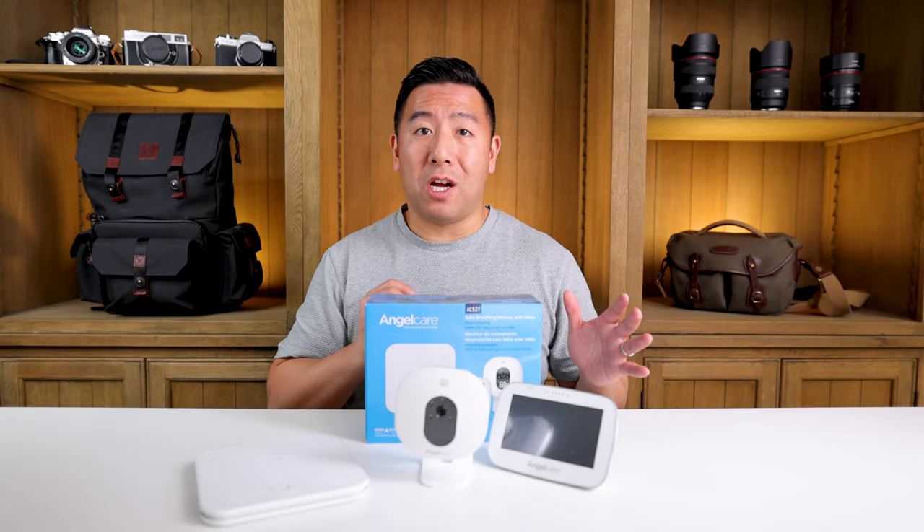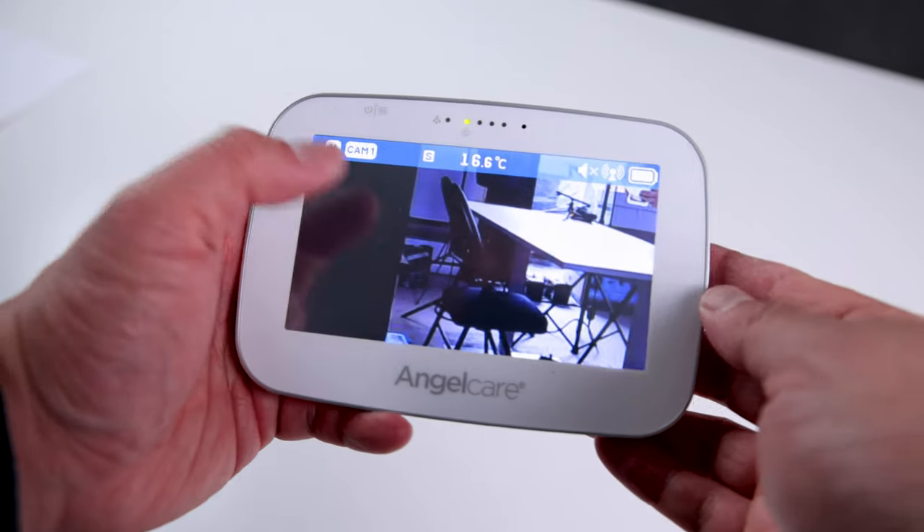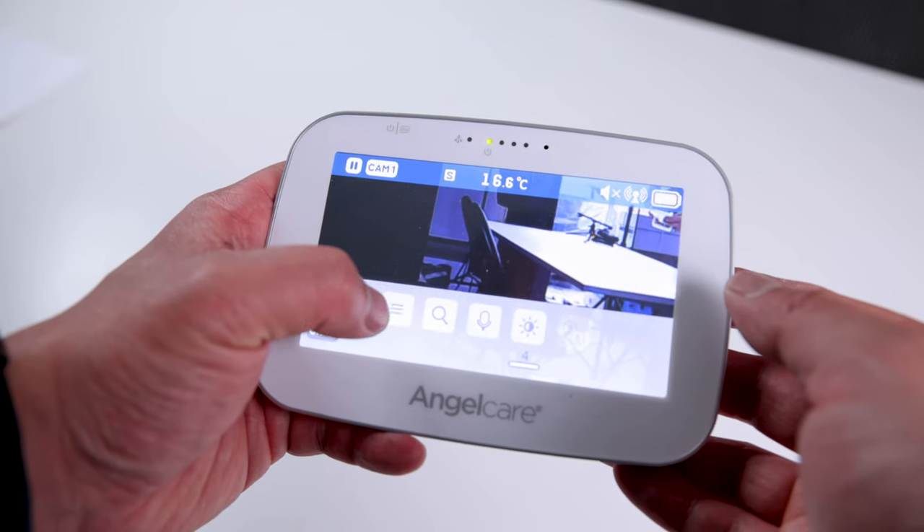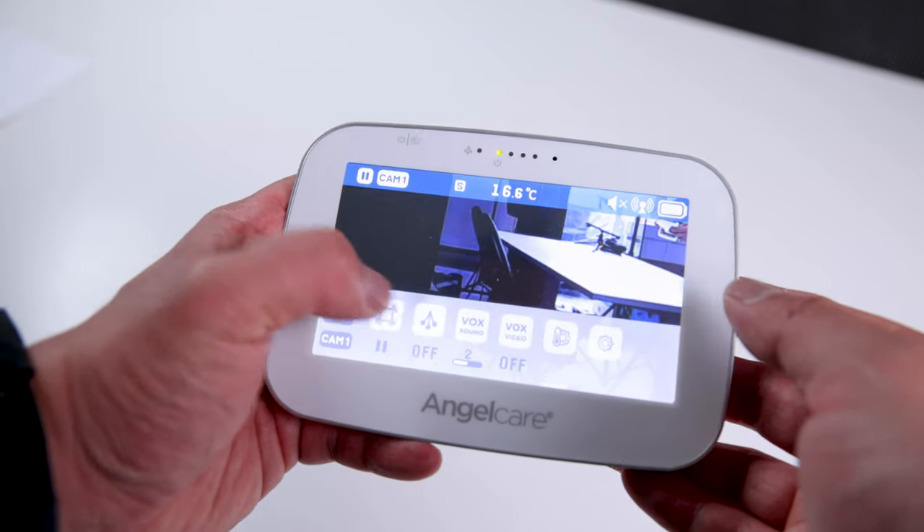You're constantly trying to touch the buttons but sometimes it doesn't sense it, so you end up button smashing. Sometimes you've pressed it too many times — it's absolutely terrible.